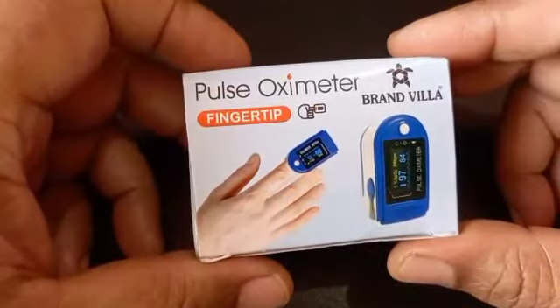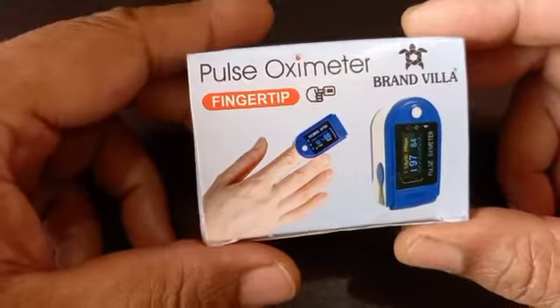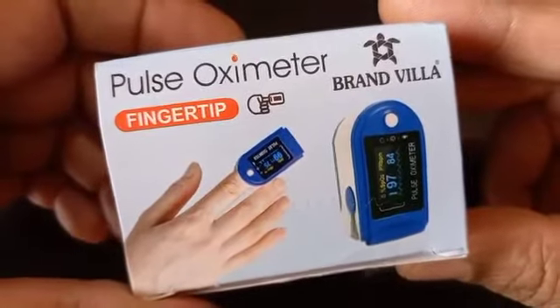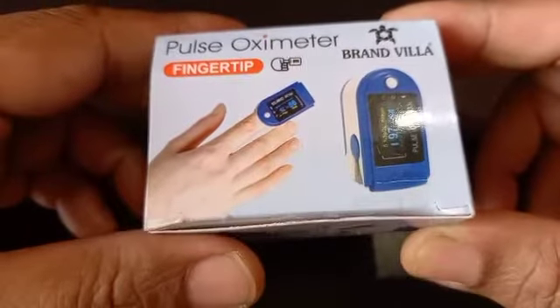First of all, I will tell you this is an Indian company established in New Delhi, and the name of the company is Brand Villa. After a lot of research, I found it suitable for me and I have been using it since that day.